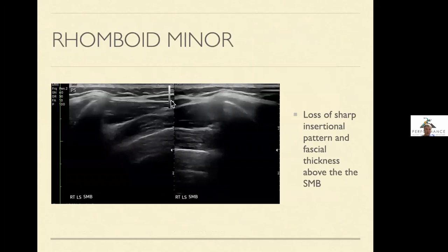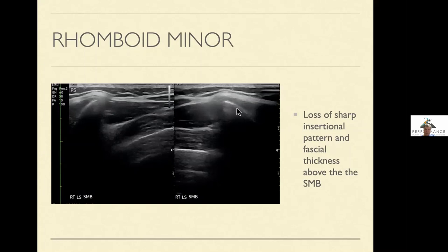When we look at the rhomboid minor — which showed bogginess and poor activation on exam — you see a much clearer image on one side, but comparing left versus right, this side is very fuzzy and difficult to interpret, with loss of normal margins. To me, this is all soft tissue swelling suggesting early tendinopathy or swelling of the tendon. The fascia also looks asymmetric in thickness, and if hyperechoic, that may represent inflammation of that fascial layer as well.